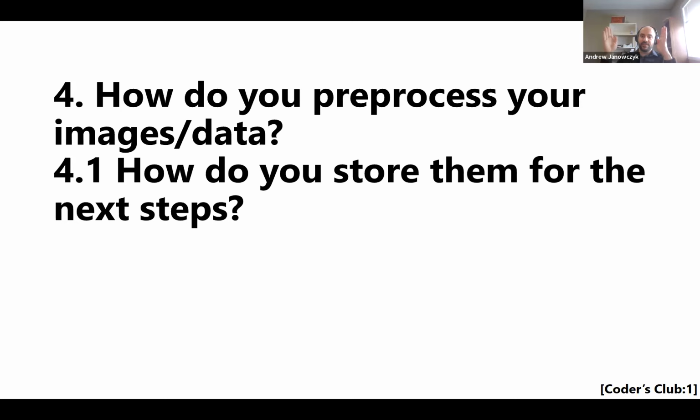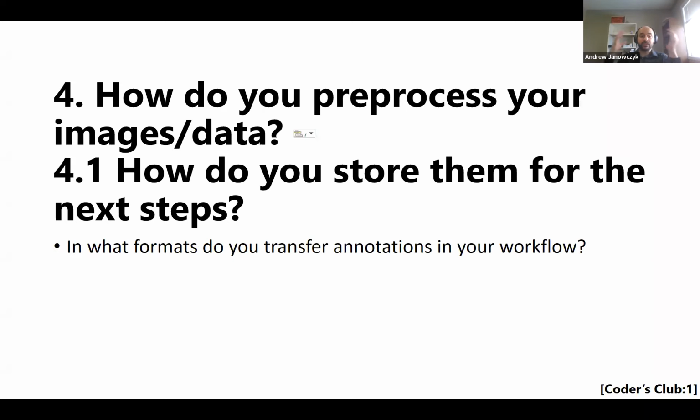So any file that's less than that size, or that doesn't line up on that boundary, you're paying for the rest of that space. So in theory, you can have a very small data set that, let's say, would take 1 gigabyte, but it ends up taking up the equivalent of 10 gigabytes on that disk, and you still have to pay that 10 gigabyte loading cost when you access it. So you end up having an order of magnitude less performance by working with smaller individual files. So there's really value in putting all of that stuff together to optimize efficiency.